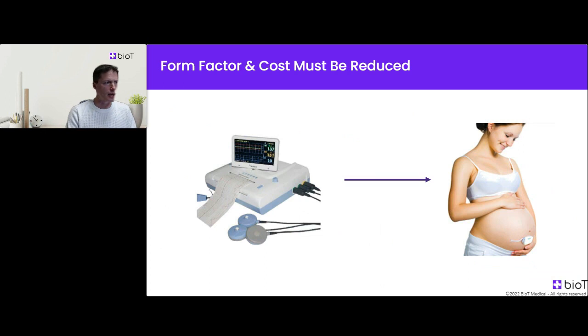So the first thing that must happen, since you're not in a hospital setting, is that the form factor must be different, and the device itself must be different. The two devices you see here are both fetal monitors with actually the exact same functionality. Of course, this left one is the clinic version, and it's clearly complex and meant for professional users, and it costs a few tens of thousands of dollars.